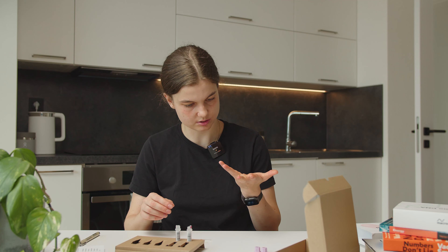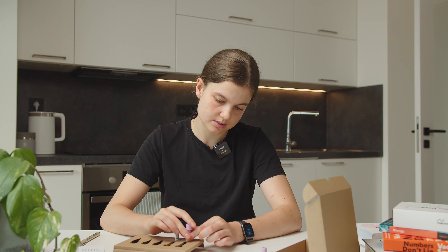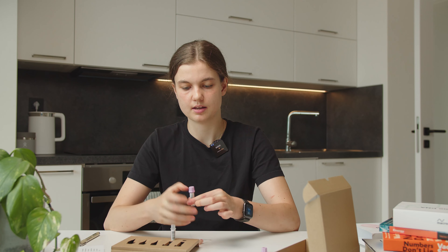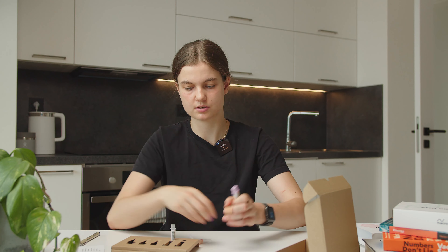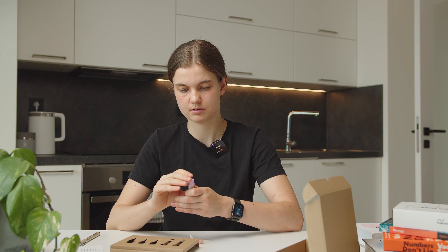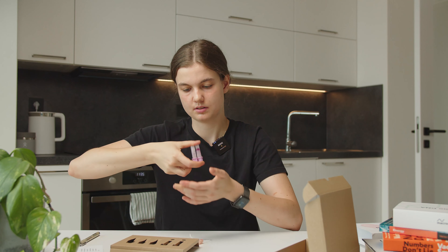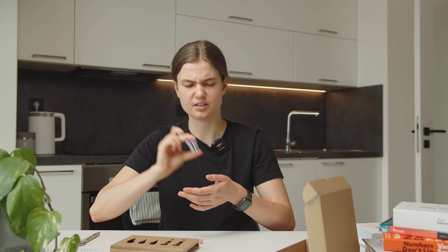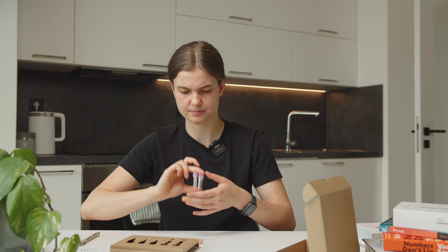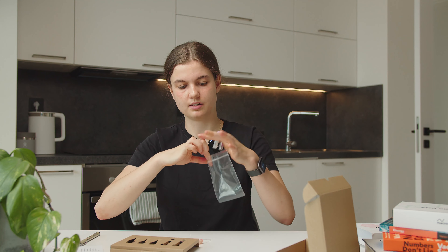I need to wrap it up — the body did its work. Now I'll place the caps on the samples until I hear a click, and then mix the blood for both of them. You just need to flip it back and forth, back and forth, maybe a little bit — you don't need to shake it as much as I did. Now I'll place them into the container.